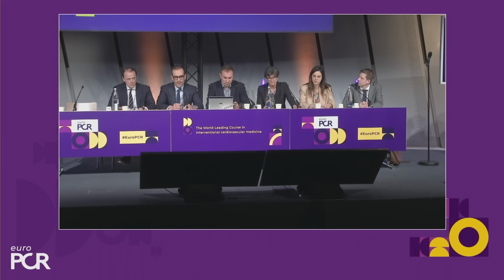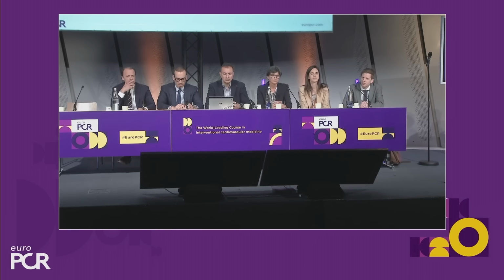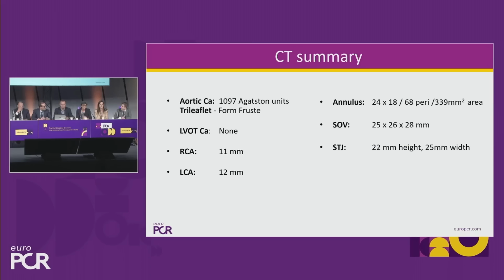Yeah, thank you. And again, I'm diving a little bit more into the procedural planning, or all what we do before planning such procedures. Thomas, looking at the sizing we saw, and maybe Iqbal, you can come back on the measurements just to remind everyone what you had. We could say we are maybe at the lower end of the sizing chart for Navitor 25.